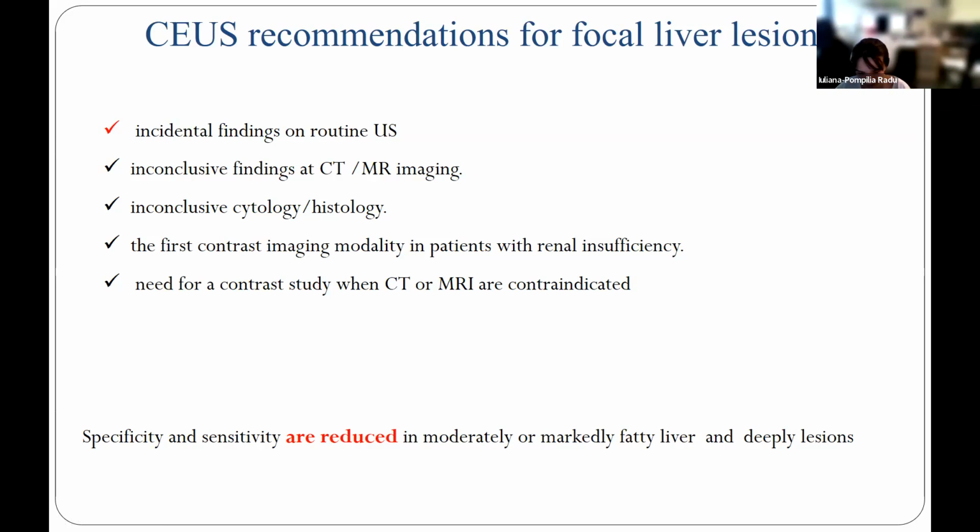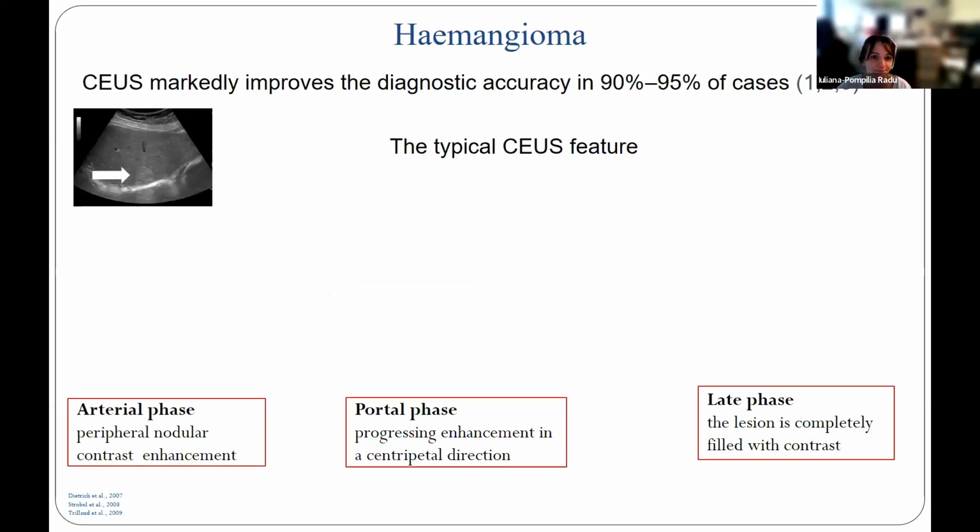However, we should bear in our mind that if the lesion is very deep or the liver is very fat, contrast enhancement doesn't bring too much information.